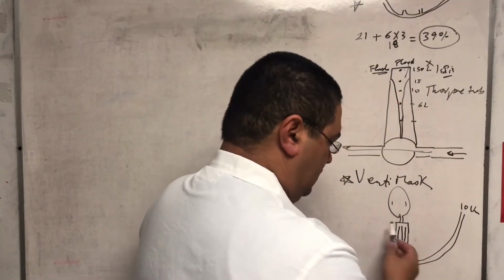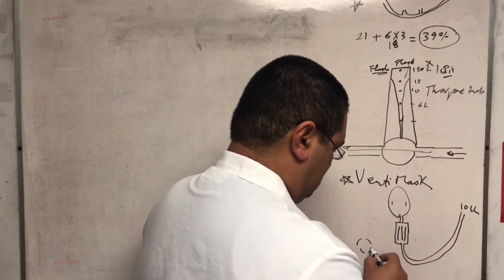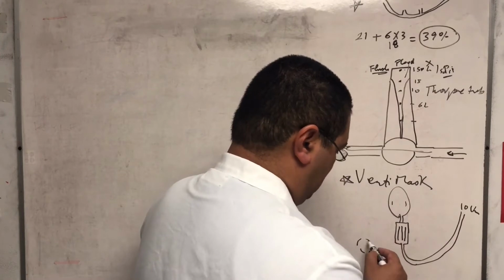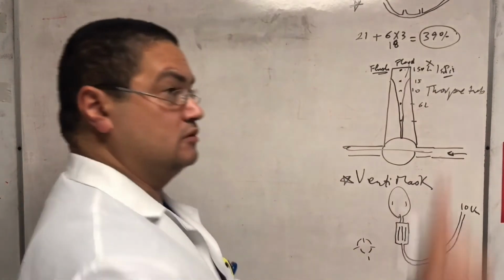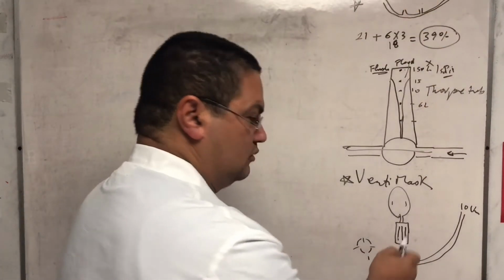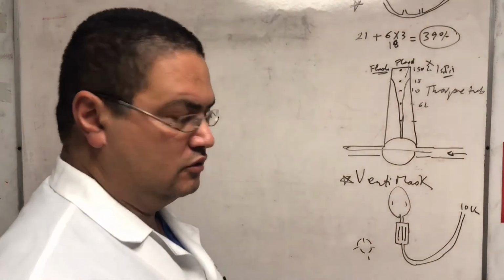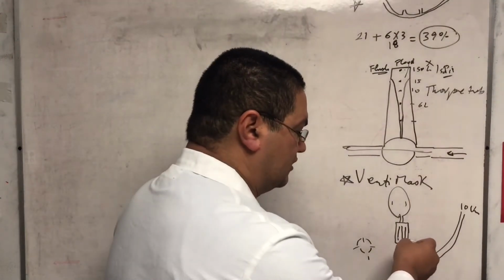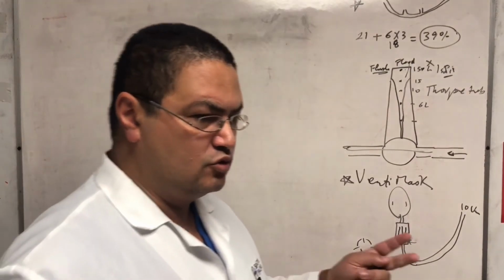Like, if you will, it looks like this. It will go through that central channel, but all of these holes here, because it's like the jet principle. Something going here decreases the pressure outside, so air will go into the same channel, so it will entrain air. By definition, it will entrain air, and the entrainment of air is dependent on two factors.